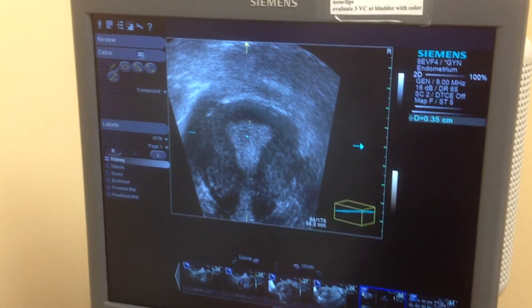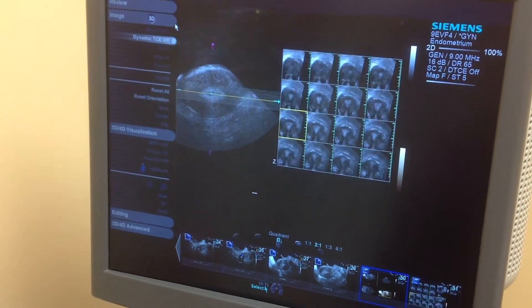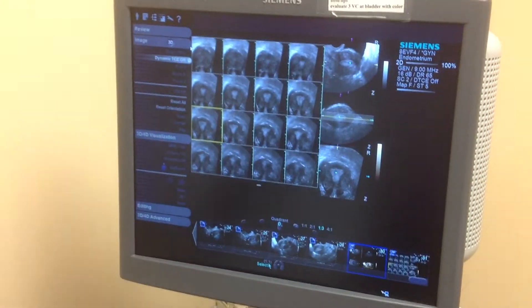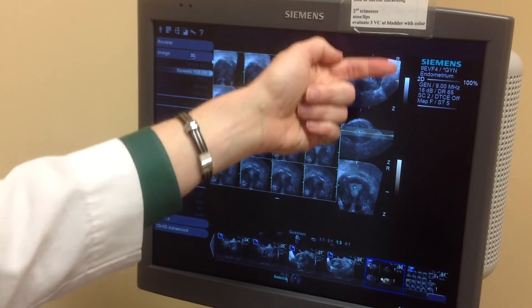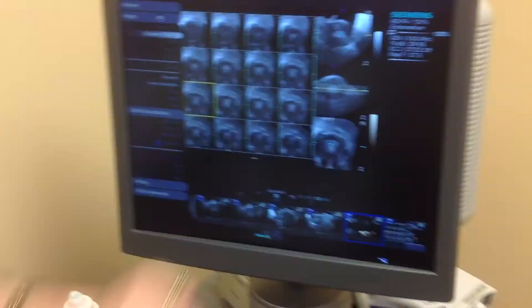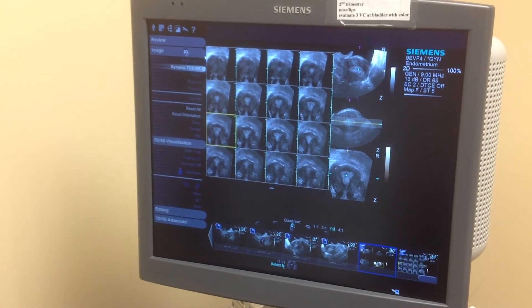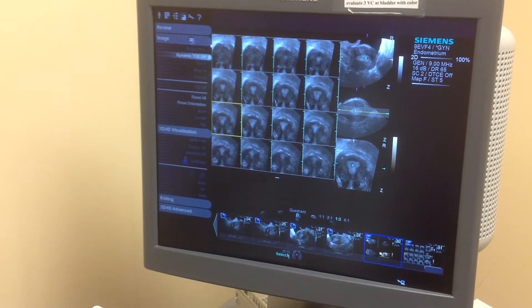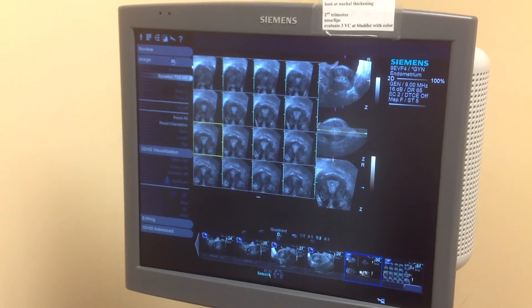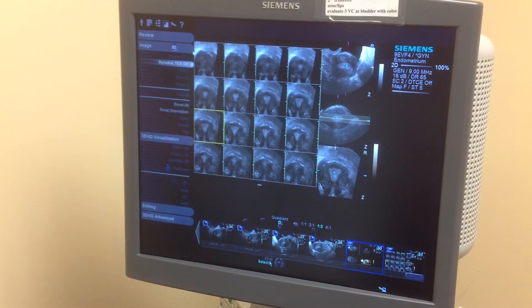A bit more about this in general: these are MPRs — multi-planar reconstructions — slices created from your longitudinal acquisition. This is your acquisition plane, which was the sagittal, and the transverse and coronal are reconstructed from all of those slices. The difference between this and what you're familiar with like baby faces is that a baby face is a surface rendering — you're seeing the surface of the baby's face, which is dimensional and covered with fluid. These are just slices going through the uterus reconstructed from your initial sweep.